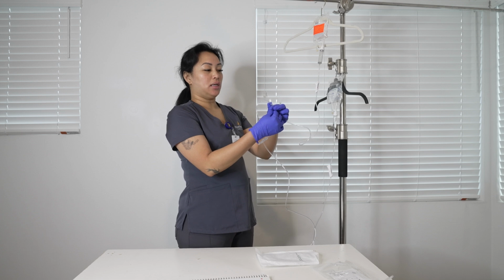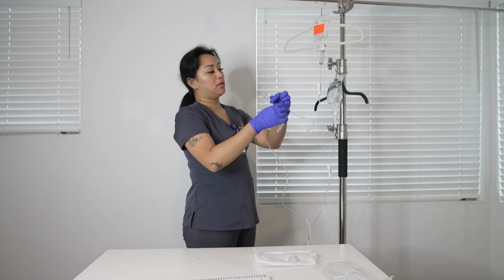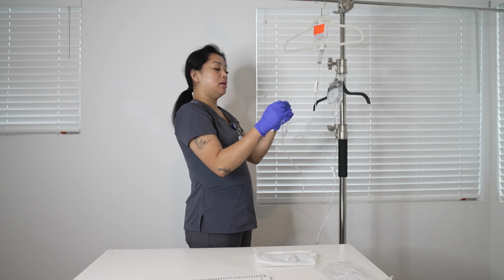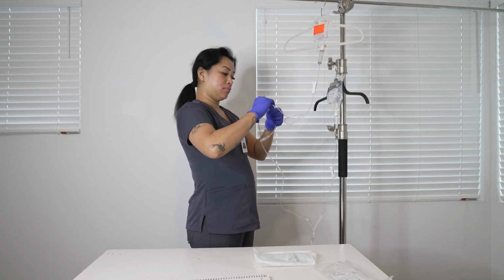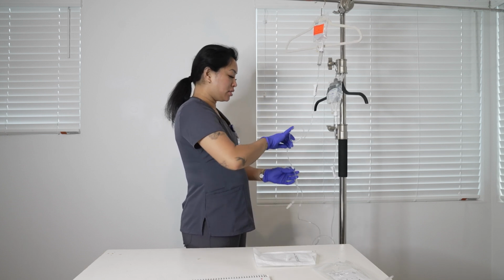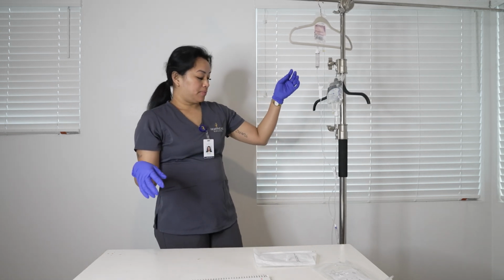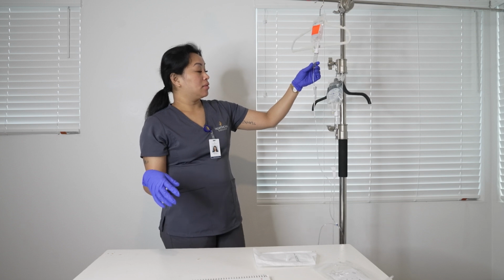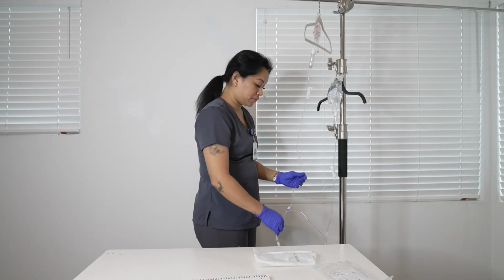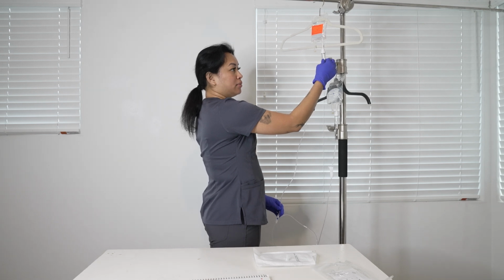Now that it is dry, now I'm going to uncap the secondary tubing, put the cap right there at a nice clean flat surface. Now I'm going to attach the secondary tubing into the Y port. Now that is attached, I am good. So now I am going to prime the medication tubing, the secondary tubing. So in order to do that, we have to fill the drip chamber halfway.